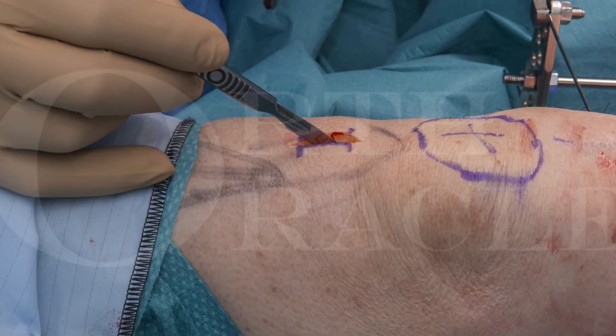Once the leg is mounted we make our initial incision. I mark the patella and the long axis of the tibia with a surgical marker. The incision is placed a thumb's breadth above the superior pole of the patella, in line with the long axis of the limb and approximately two centimetres in length. If the patellofemoral joint is tight and it's difficult to insert the trocar, this can be extended laterally with a minimal lateral release of the patella. Once the trocar is in position the trochlear will guide it onto the proximal tibial entry point, and the guide wire is then inserted through the trocar.